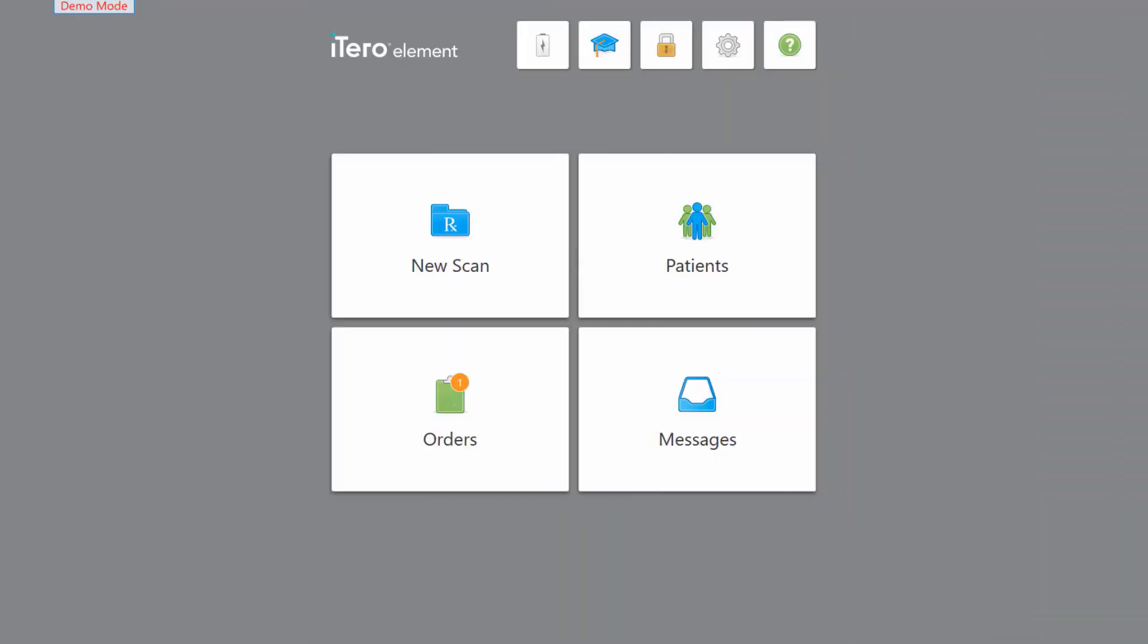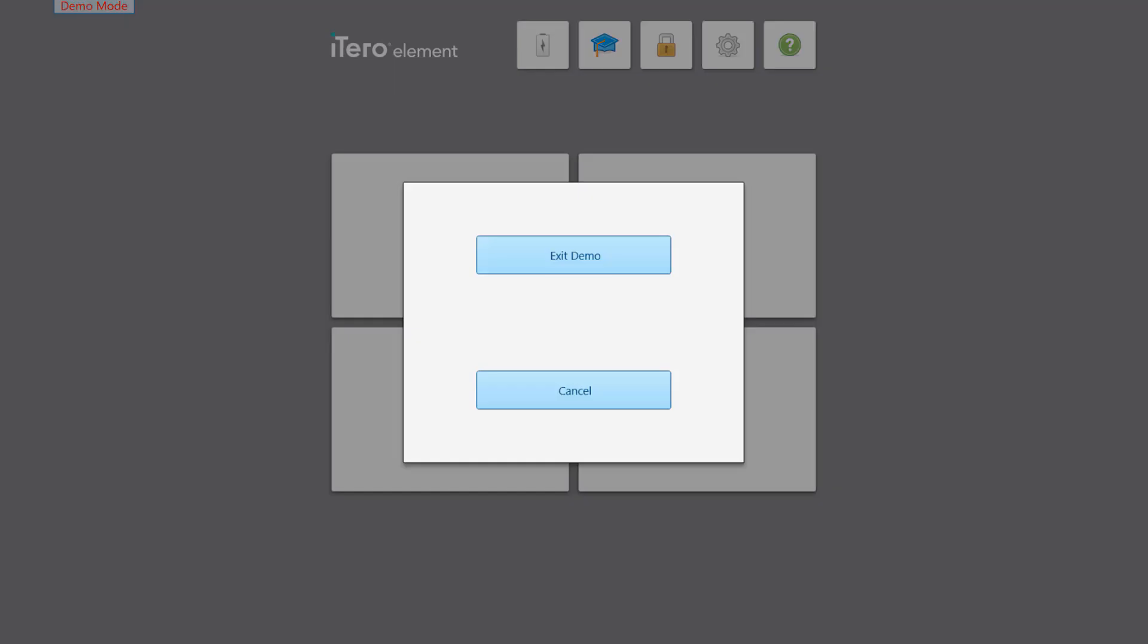To avoid accidentally scanning actual patients in demo mode, be sure to exit this mode when finished. Tap the iTero logo and tap exit demo.